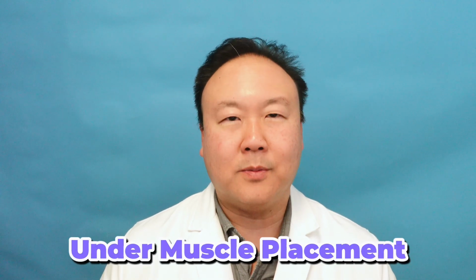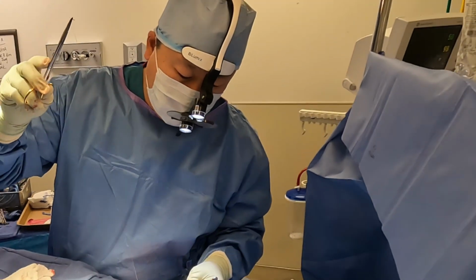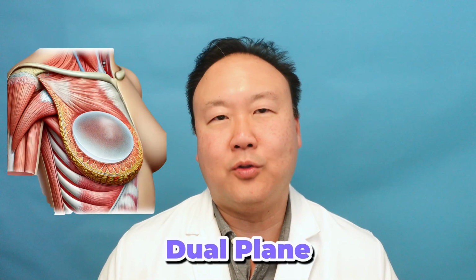Now, bear with me. We're gonna go straight forward to under muscle placement. So what I need to do is lift up the pectoralis muscle. I need to create a circular pocket for the implant, and I need to put the implant underneath it. Under the muscle, or sub-pec, is a little too easy to state. We as plastic surgeons love to be a little more precise, but also use confusing terminology. So what we call under the muscle is really dual plane.